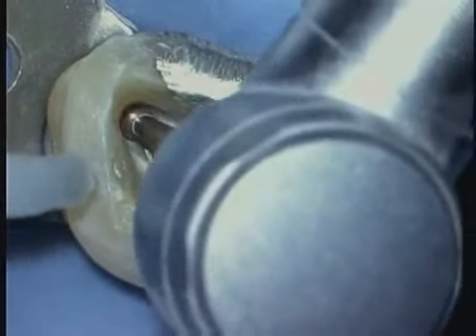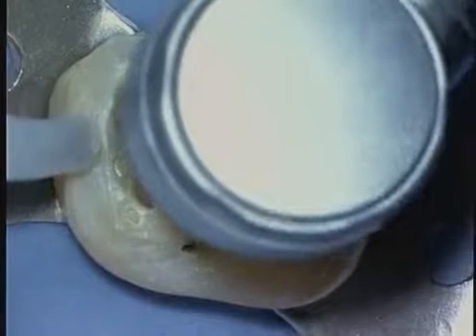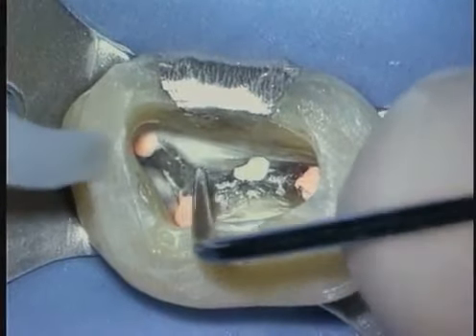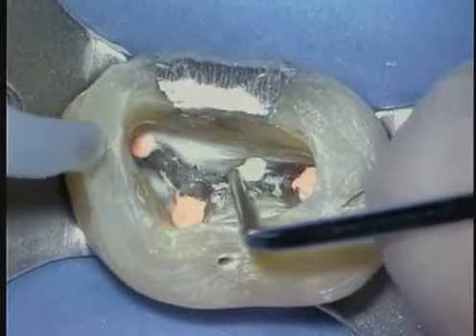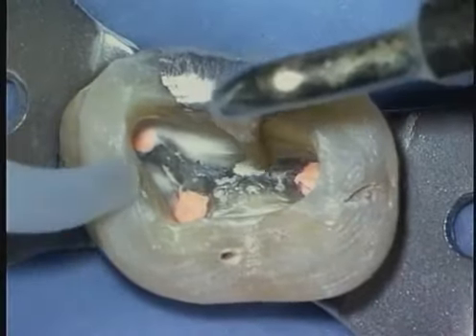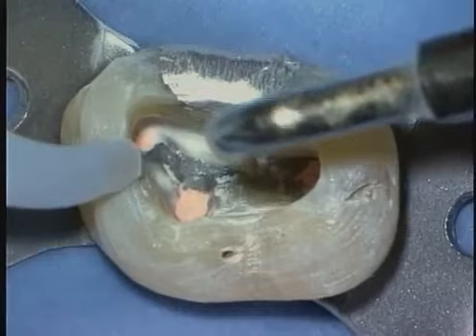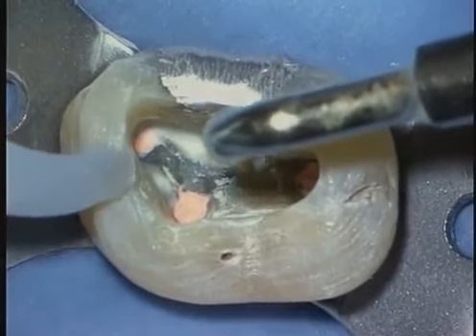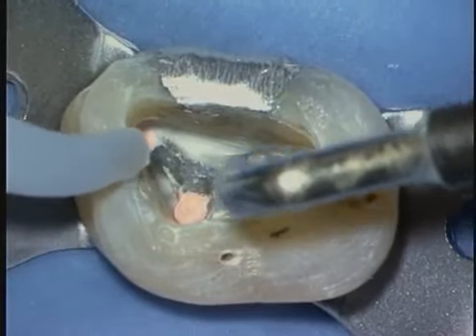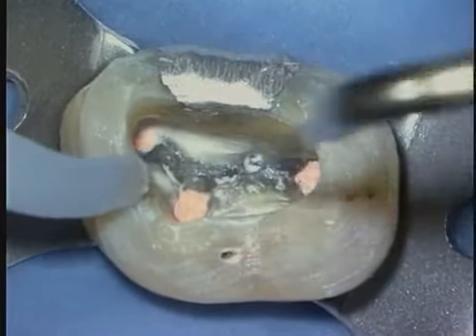Now, a lot of times we've been trained to look for the MB2 on an imaginary line between the MB1 and the palatal. And although frequently there is a groove there, and firm explorer pressure can be used to lean on it and see if you can pop through a roof of overlying dentin, we have to be aware that orifices can sometimes be displaced, and in this instance it looks like there's some material very close to the palatal system. In fact, this material may be there resultant to the pack on the original case. But we can begin to work on this area with ultrasonics and very carefully sculpt away the material. Notice the color distinctions between the pulpal floor and the axial walls.